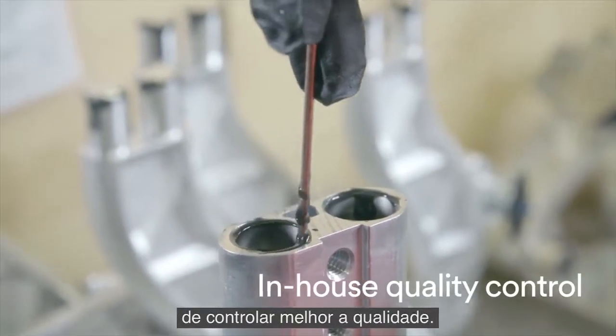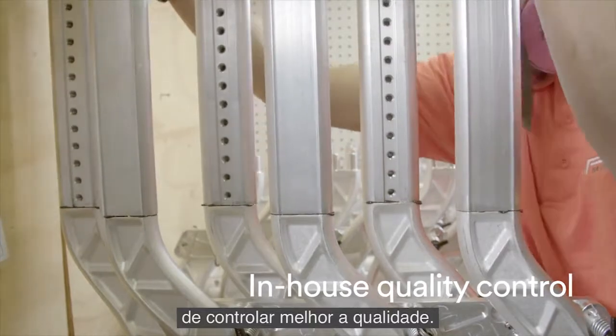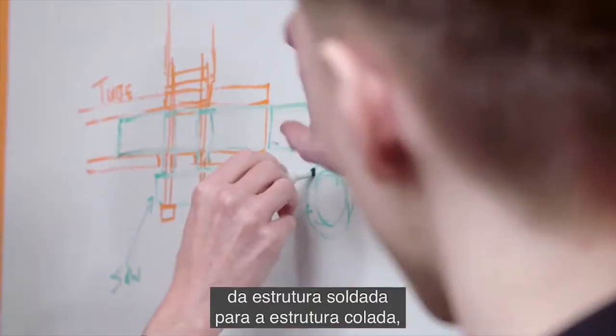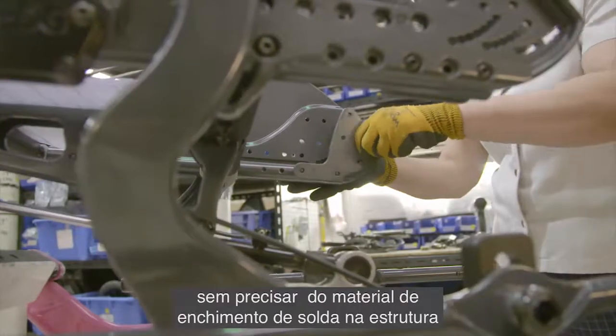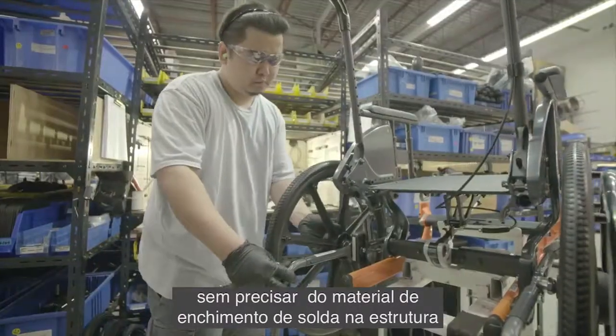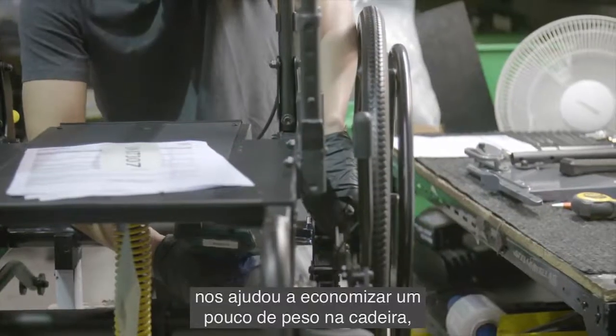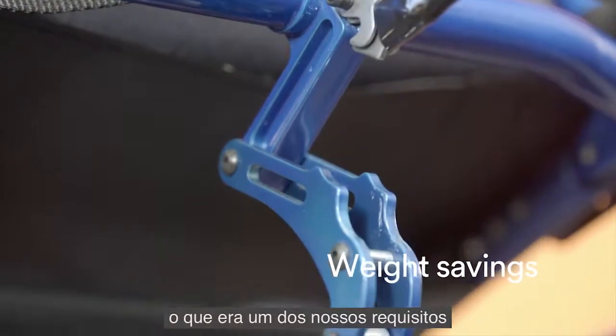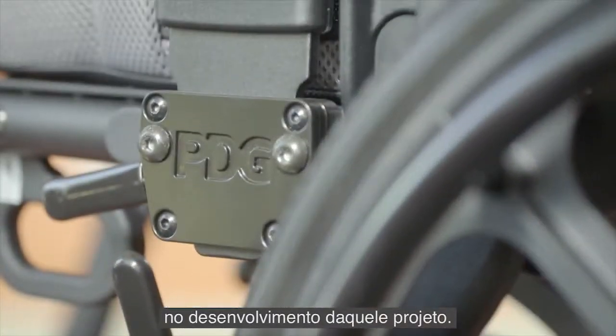Because of that, we've been able to control the quality better ourselves. When we did the switch from a welded frame to a bonded frame, not having the weldment filler material added to the frame helped us get some weight savings out of that chair, which was one of our requirements in that development project.